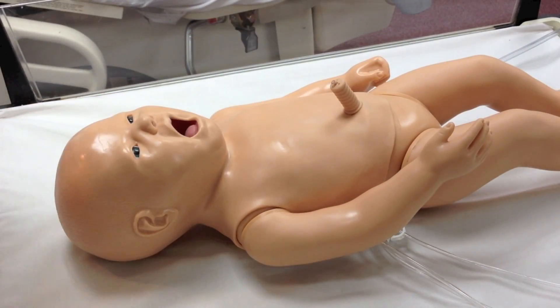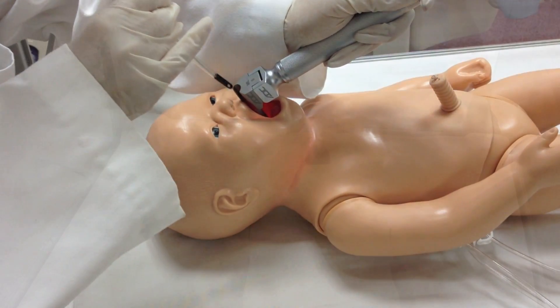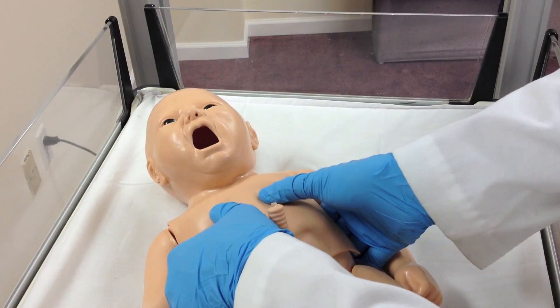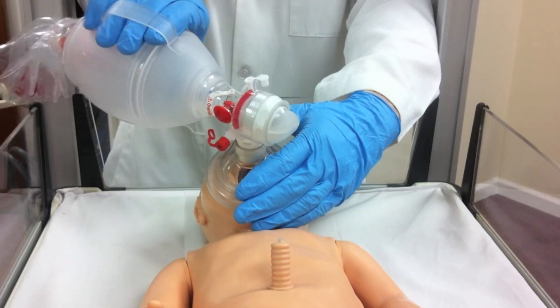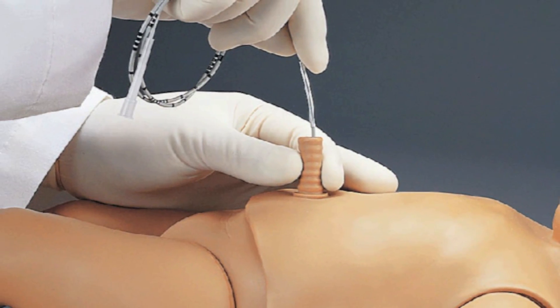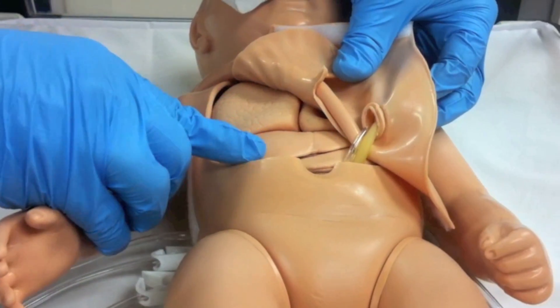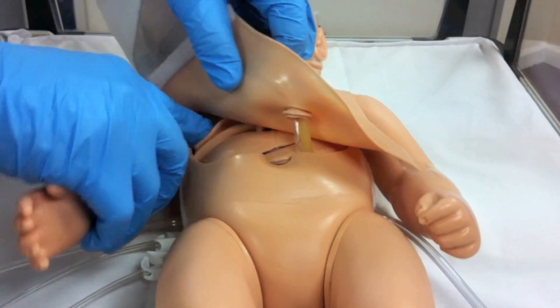The neonate can be intubated orally or nasally. Students can perform CPR and provide medications through the umbilical cord. The upper torso contains the heart, lungs, and ribcage, providing anatomical landmarks.